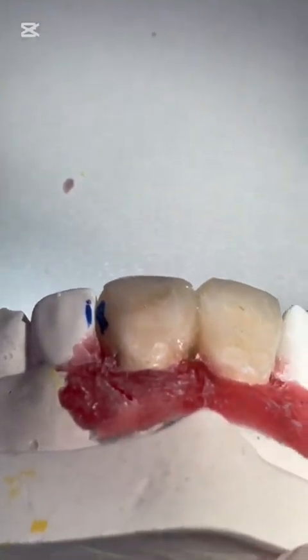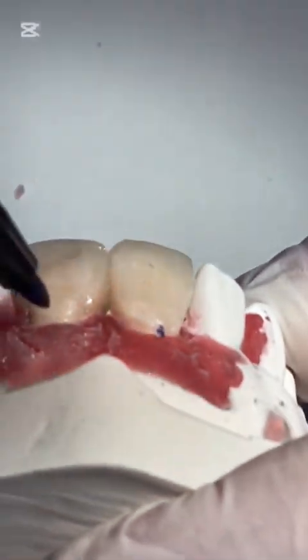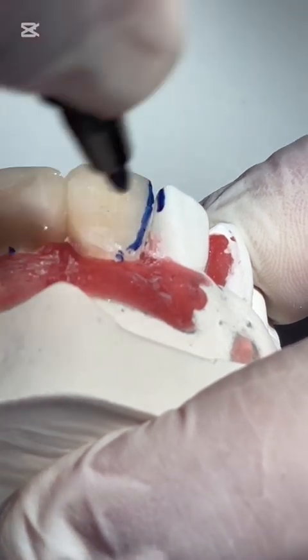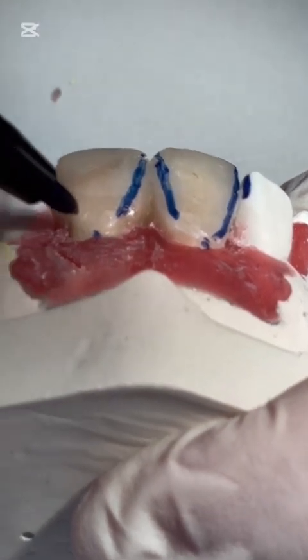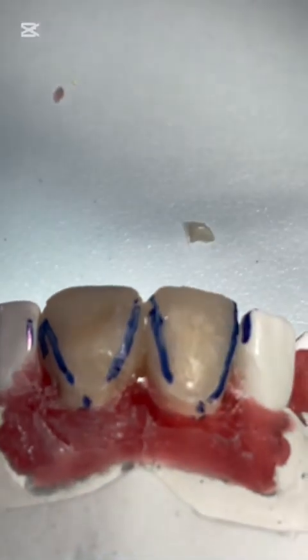Okay? Then I will determine where the transitional lines are. Here is the zenith point, which is the highest point in the central incisor. Here is the distal transitional line. Here is the mesial transitional line. So this should be parallel with it. Okay? Then the teeth are going to be similar.